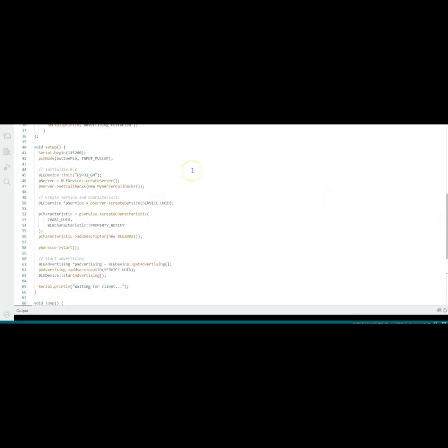This is our service UUID. Now our characteristic 1 UUID. These have to match to the MIT app so it can connect successfully. Here we handle the callbacks and make sure that the client is connected. In the setup, we begin the serial monitor, even though we're not using it for this project. We set the push button as an input pull-up so we could read the button state. And this is the name of our device, the name that's going to appear when we try to connect it to our phone. Here we just start advertising the device.